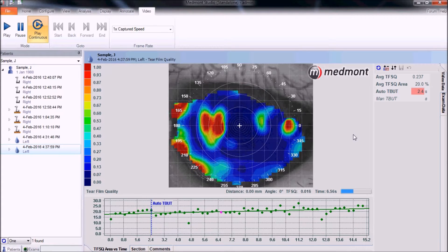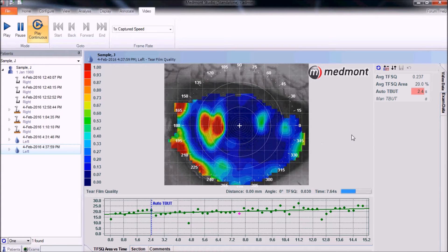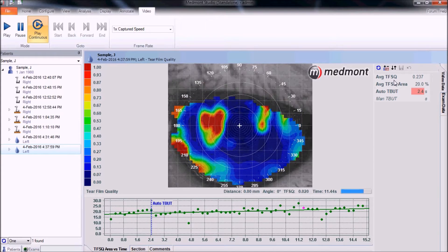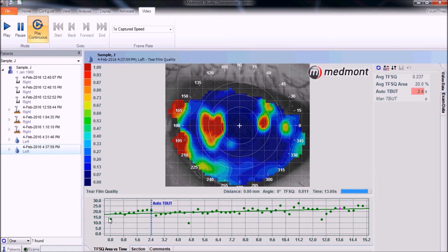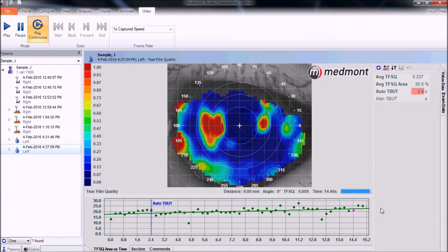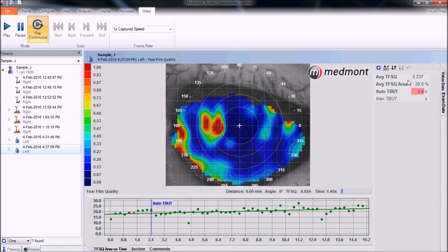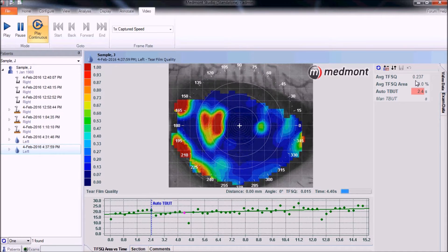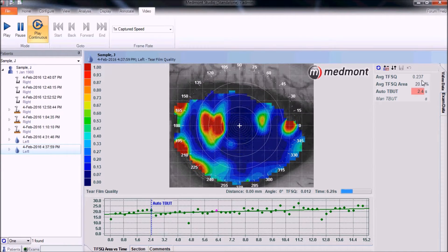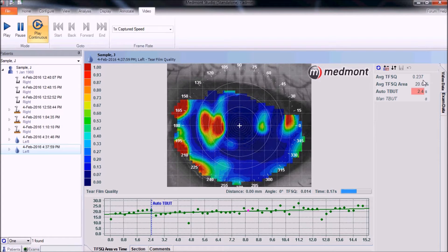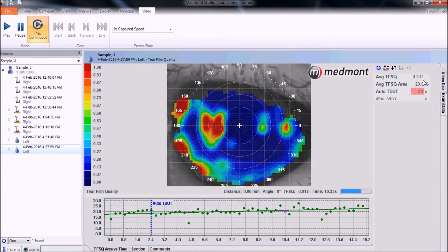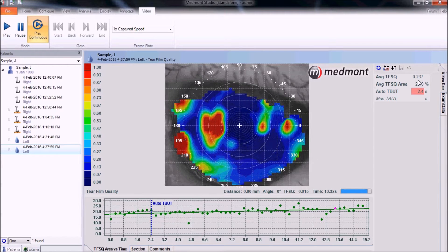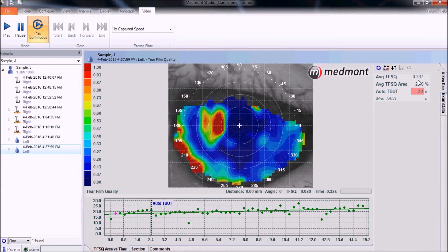In the upper right-hand corner, you can assess the average TFSQ score across all images taken over time. This indicates that the average dryness score is 0.237. Patients scoring over 0.1 are considered to have dry eye, so this patient is over double the dry eye threshold.